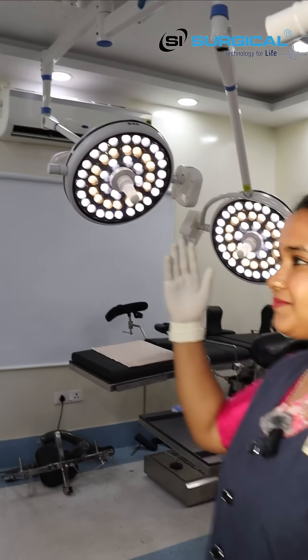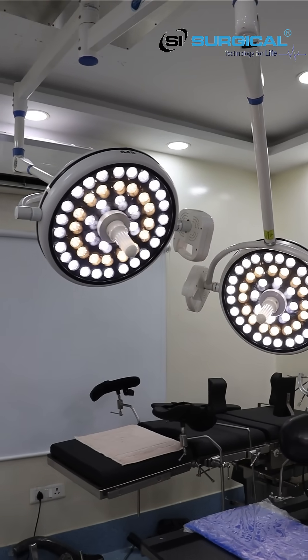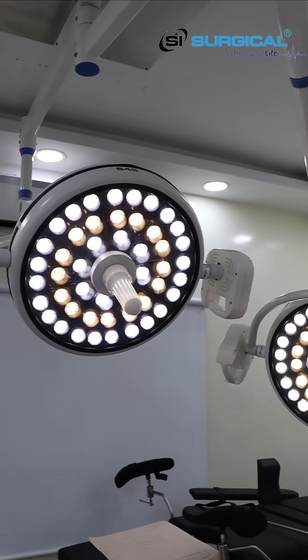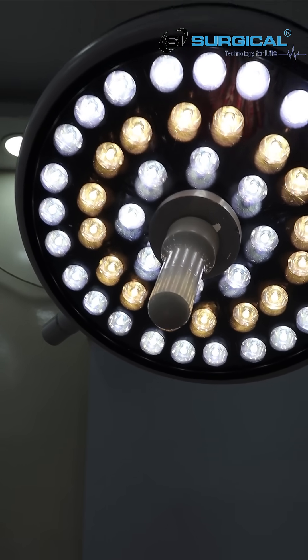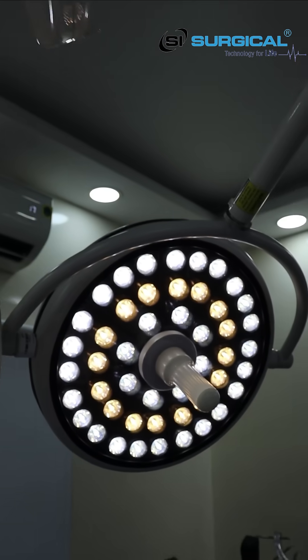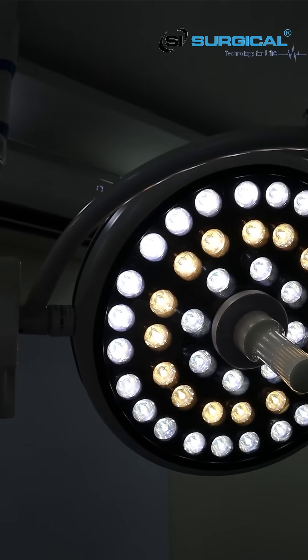Welcome to SI Surgical. Today we are showcasing our OT Light S48 Plus. It has adjustable focusing with fully remote controlled, saddleless features.